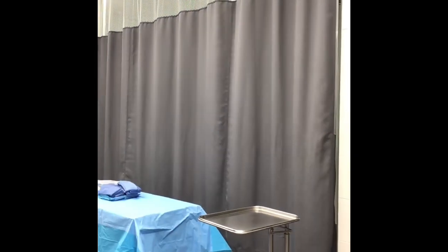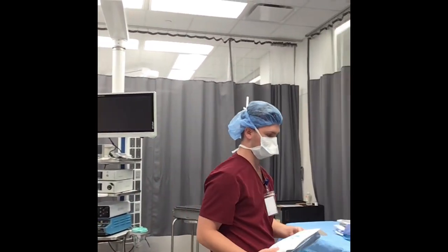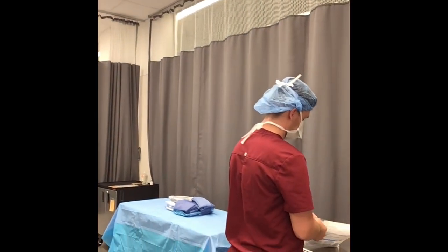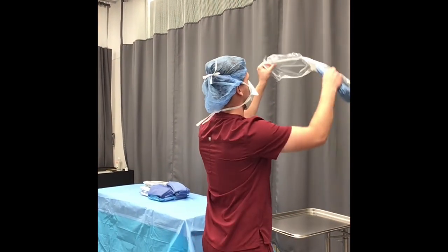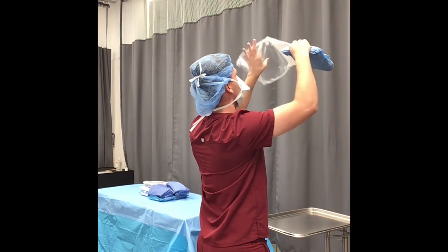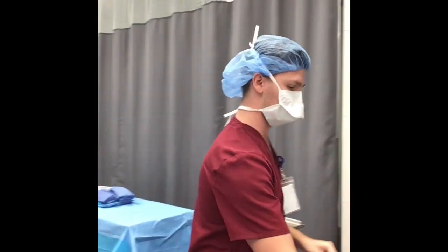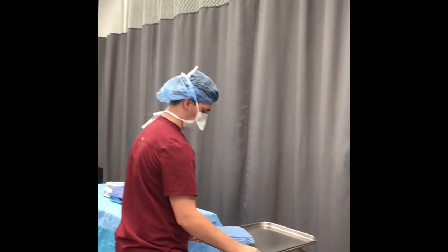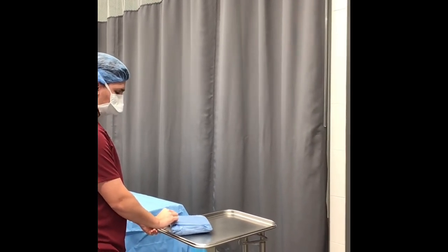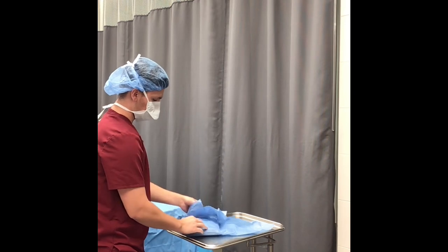Now that I ended up here, I'm going to go ahead. So I always start from my back table and work out. So the next thing I'm going to do is open up my sterile gown. So I'm going to go ahead and check my dust cover. Again, same thing, making sure there's no tears or rips or holes. Dispose of that. Okay, and then my first flap is going to, again, same thing, this is envelope wrap, so my first flap's going to open up away from me. Then I have my two side flaps.